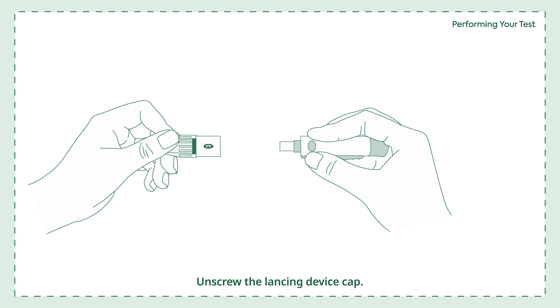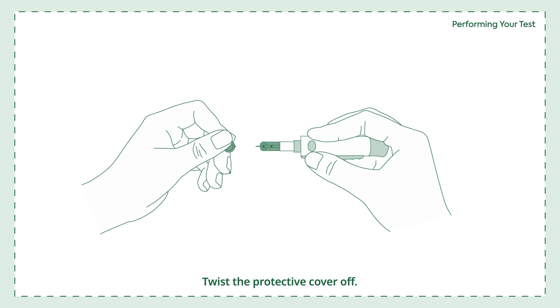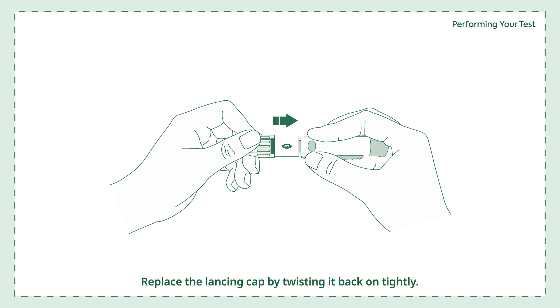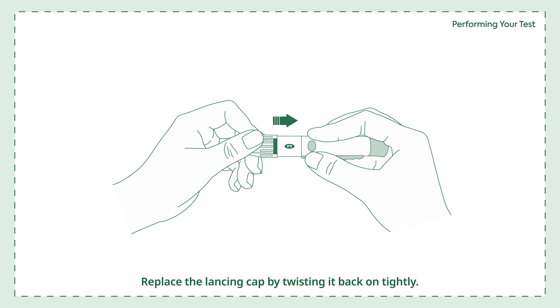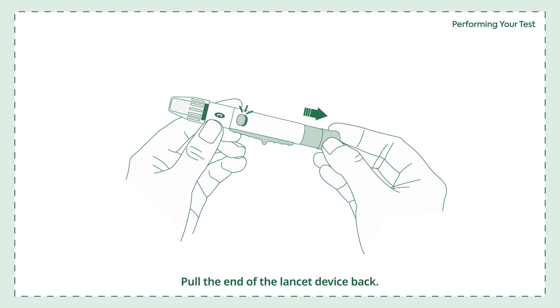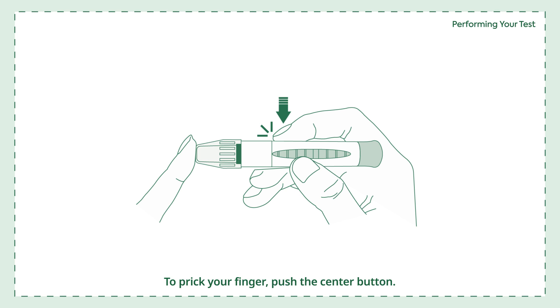Unscrew the lancing device cap and insert a sterile lancet. Twist the protective cover off — do not discard it, as you will need it when disposing of the lancet after testing. Replace the lancing cap by twisting it back on tightly. To adjust the depth setting: use 1–2 for soft skin, 3–4 for average skin, and 5–6 for thick or calloused skin. Pull the end of the lancing device back until the button pops up.